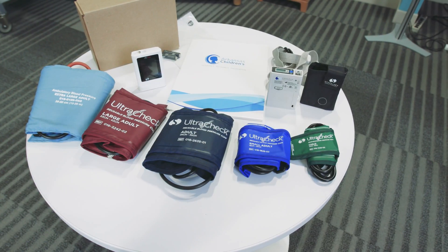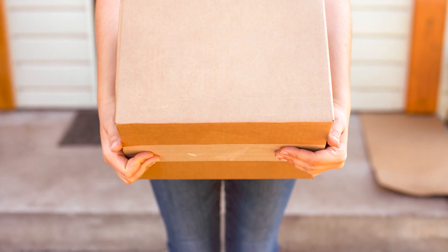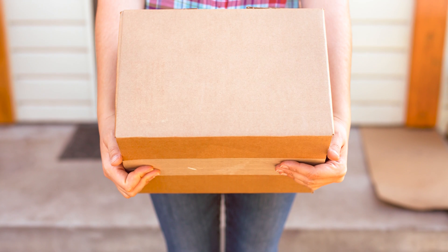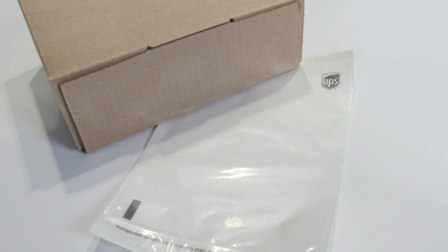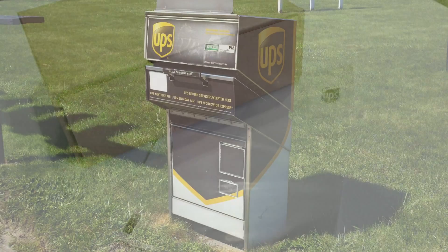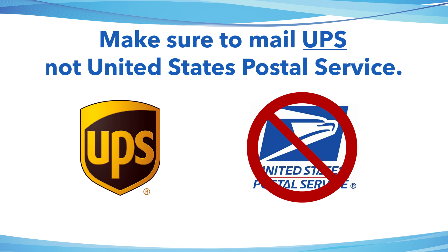The nurse in the clinic will provide you with the materials needed to return the equipment. Place all the equipment, paperwork, and diary in the box provided. Put the UPS return label on the front of the box and return to any local UPS drop box. Make sure to mail UPS and not US Postal Service.